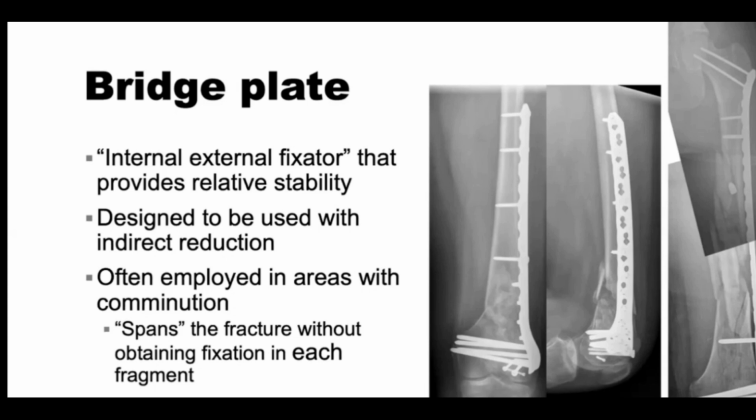And interestingly, you'll see a couple independent screws that are outside the bridge plate construct. And this is what Dr. Haynes was talking about when she says in different parts of the body, you may have a plate that's designed to be used in one kind of mode, but there may be additional plates or screws providing a different function in another part. And so I suspect that this patient had an articular fracture. It's important to get articular fractures lined up as perfectly as possible with anatomic or direct reduction and absolute stability. So that's probably what those screws were providing that are down there closer to the joint.